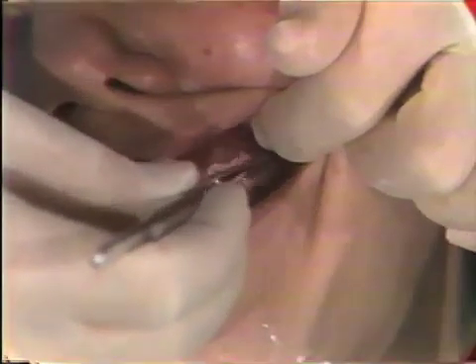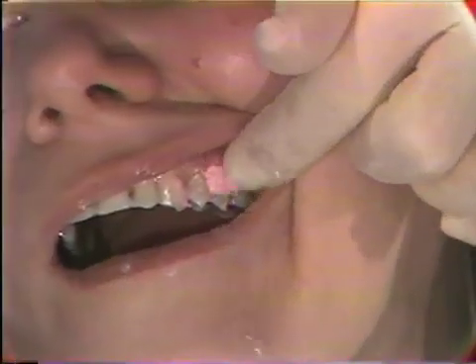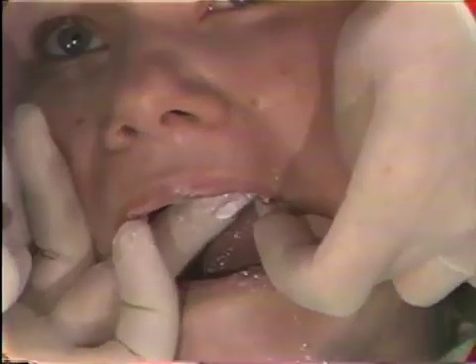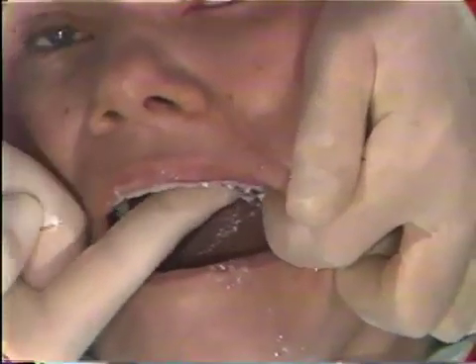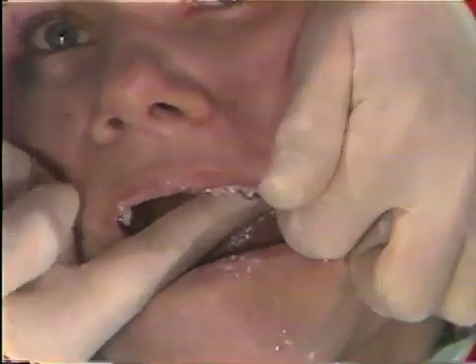Darlene will roll the second piece of dressing material in the powder so it has powder incorporated in it, just before handing it over again. Notice how white that is — it's just loaded with powder. The dressing material is carried into the mouth with the fingers. It's the same on the lingual as it was on the buccal. One finger is used to press it interproximately and to thin it out so it isn't too bulky to the tongue.